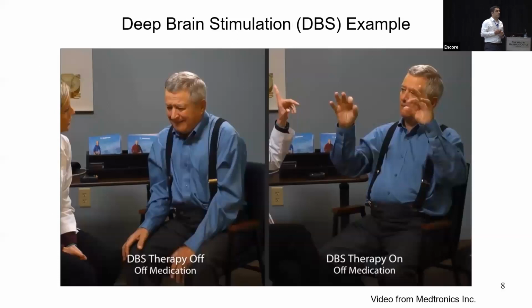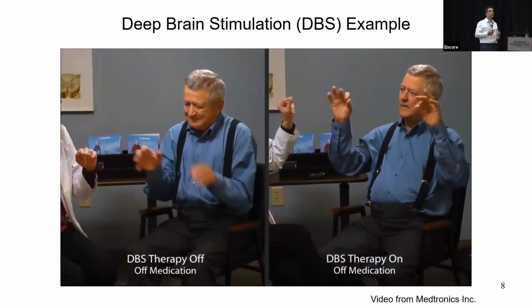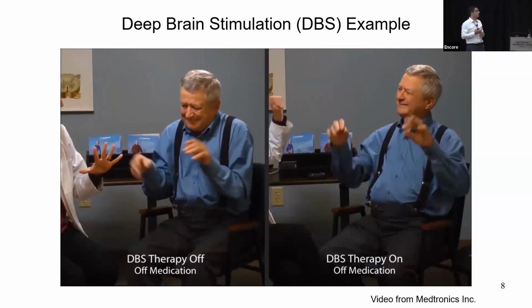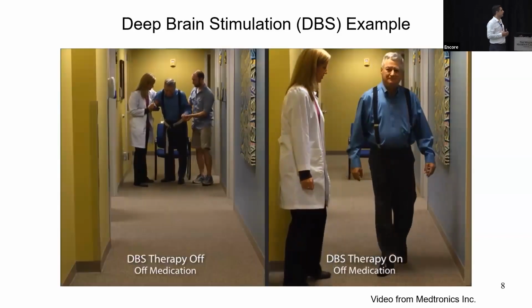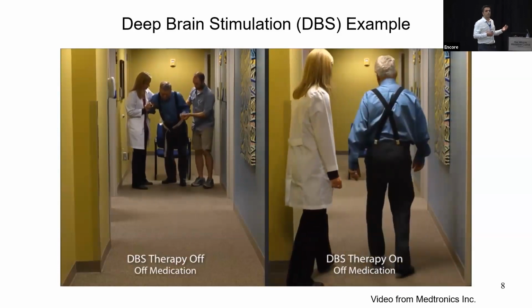Perhaps the best way to see the impact of neurostimulation is to see how it affects patients' lives. In this video, you can see a Parkinson's disease patient off medication. And when deep brain stimulation is turned on, a lot of the symptoms of Parkinson's disease are suppressed greatly. Motivated by many examples like this, people looked into the use of neurostimulation for other neurological disorders, including epilepsy, which is the topic of our talk today.